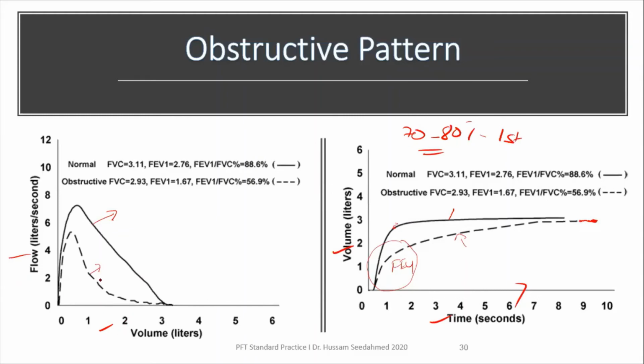طيب in the flow volume curve, this is usually looked at as scooped end. This اللي هي الحركه دي عندي لو متذكرين قبل اتكلمت عن الكيف انه لازم يكون عندي a linear decline. هنا ده بكون scooped. So this is scooped اللي هي end. This indicate obstruction. This is a scooped end. So this is the obstructive pattern.